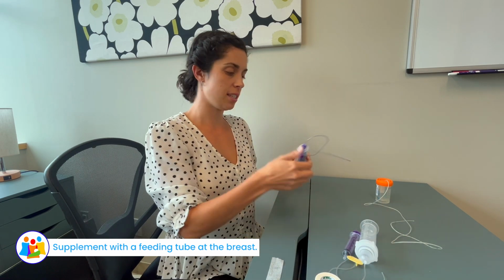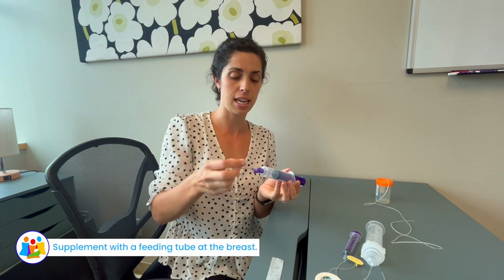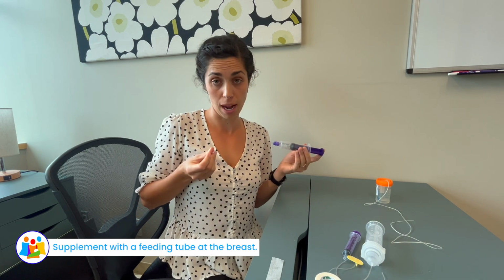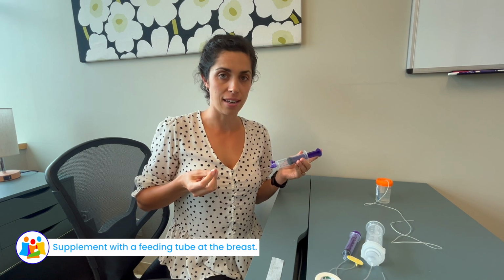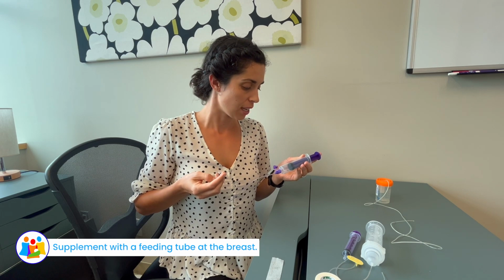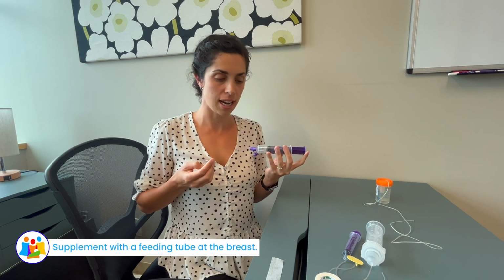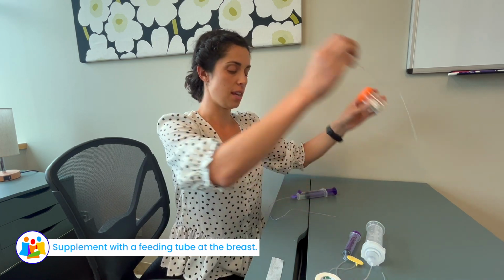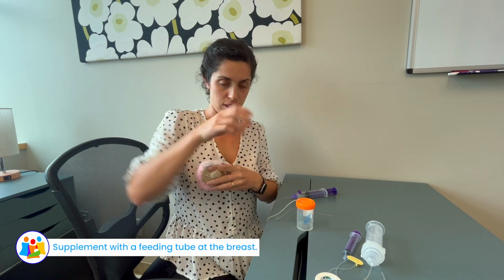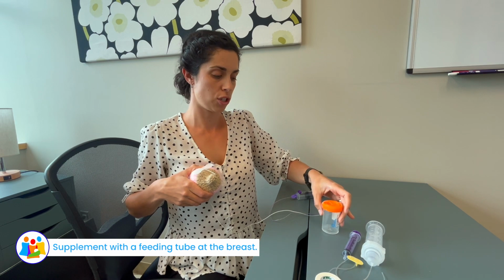Another style is the syringe, where this is also a feeding tube with the 3 holes on the end, and the syringe is filled with the milk and then can be primed with the pressure applied and slowly dispensed into the baby's mouth. I find moms don't generally like this method because their hands are tied up, and with this method, once it gets going and the baby's drinking, they have the canister down and they can be supporting the breast, holding the baby, and this is placed wherever they so wish.